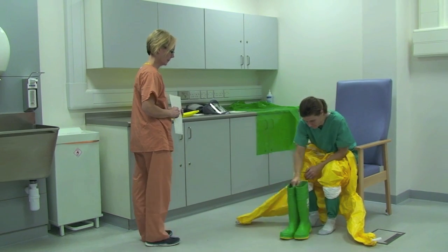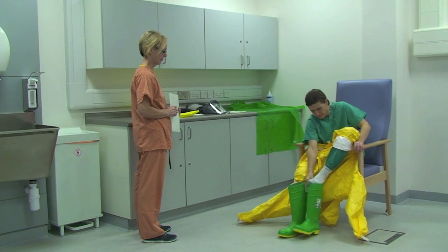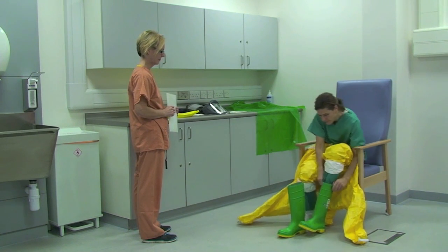The healthcare worker puts on wellington boots tucking the scrubs into the boots. If there are no wellingtons then covered shoes should be worn.